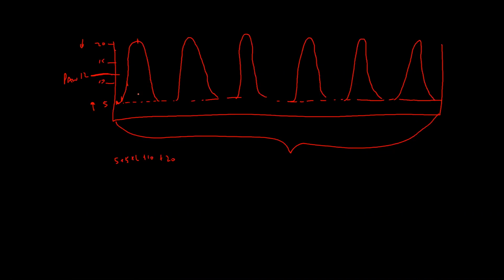Okay, so there are certain things that I can do to increase the mean airway pressure. I could, for one thing, increase my PEEP. That's a really great thing. What if this was 10? And then we're up here at 15 and 20 and 25. Well, that would increase it because now my mean airway pressure is somewhere above 10, below 25.